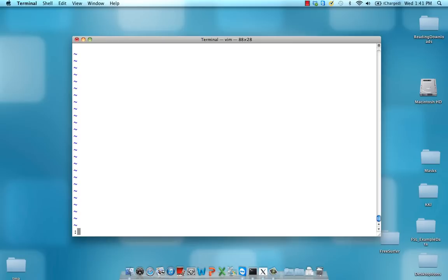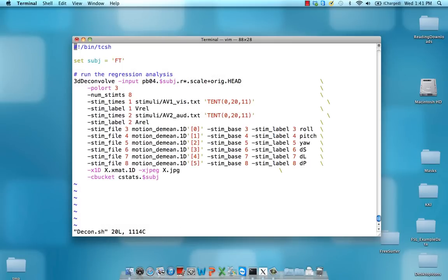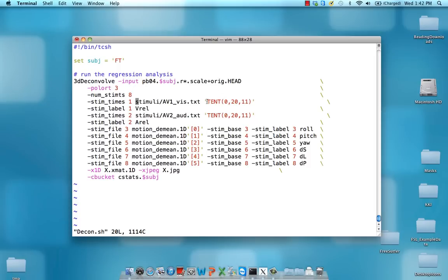So here's the deconvolve script I'm going to be using. Notice it's very similar to what comes with that dataset that's already online. All I've done is I've changed the basis function we're using from the gamma—that canonical hemodynamic response function—replacing it with this tent.